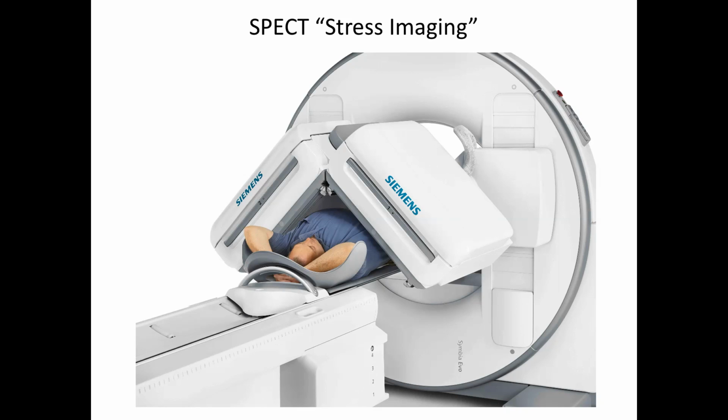But an X-ray is created through mechanisms using the electrons in an atom. This 140 keV photon comes out of the nucleus. And so you can call it a gamma ray, even though they have the same energy, because it's through a nuclear transition that this comes out. However, once it's a photon and it's 140 keV, it's going to behave like it doesn't remember where it came from, right? It's just a photon. Off it goes. So it's a pretty high-ish energy X-ray, or low-ish energy gamma ray. And so it can exit the patient.